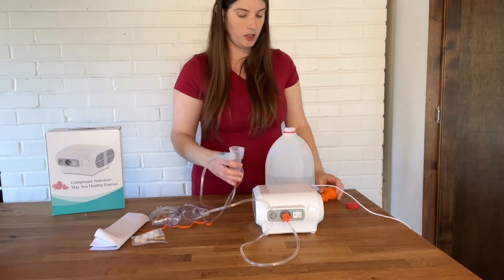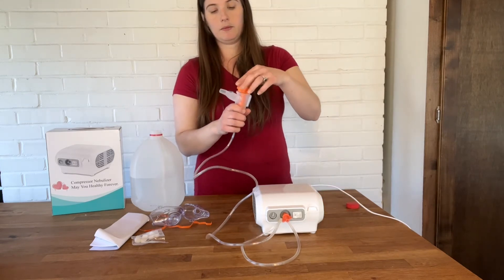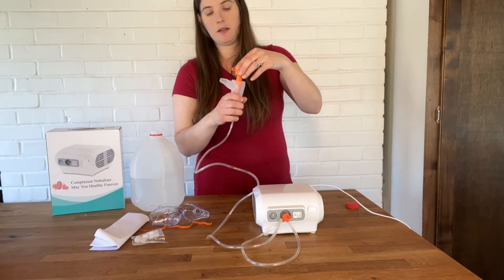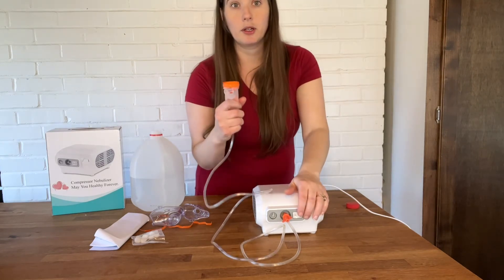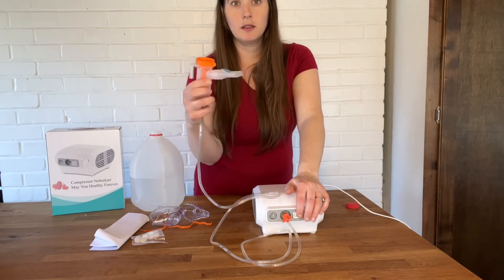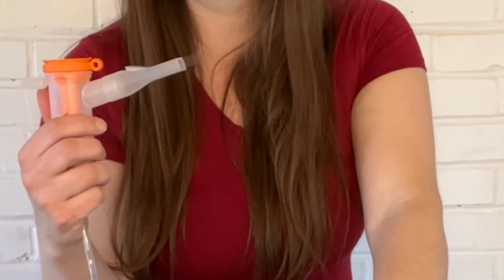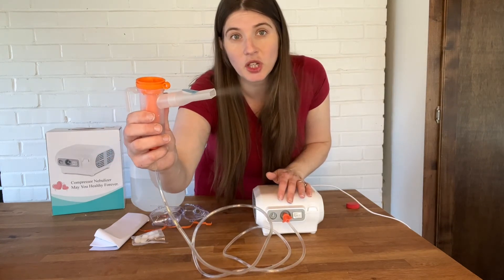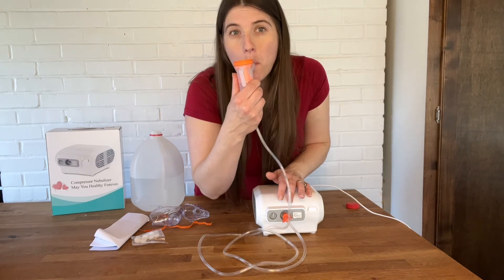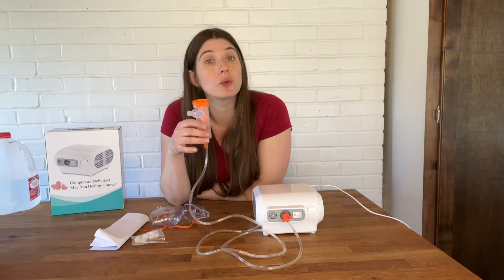I'm going to put some distilled water into the cup to show you today. And we're going to turn it on. Notice you get some good steam to use.